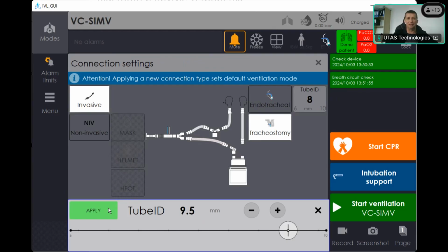Because the ventilator has a record of resistance and compliance of the ET tube, and if you try to activate tube resistance compensation, the compensation criteria and compensation data will be used according to the records for the tube diameter you have selected here.